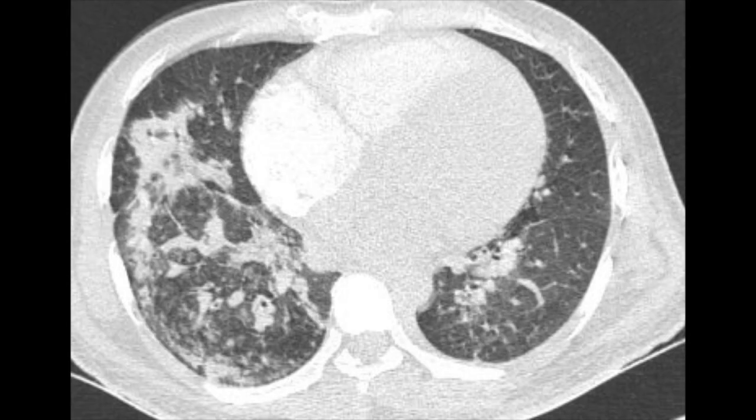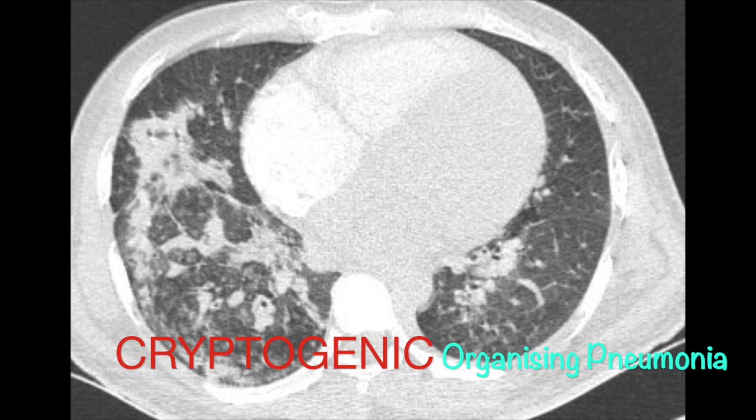What do you have here? You want to call it NSIP, right? But this is not NSIP. These are multiple consolidations, of course with septal thickening and round lesions. When you have consolidations which are peripheral — more triangular, subpleural — think of cryptogenic organizing pneumonia, initially called bronchiolitis obliterans organizing pneumonia (BOOP).